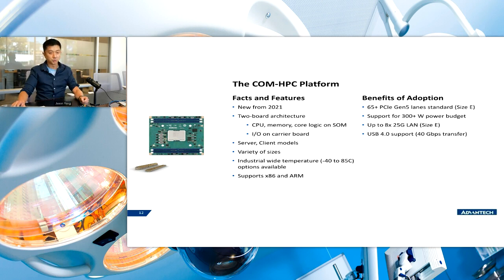We'll dive into the COM-HPC spec specifically. The flexibility of COM-HPC allows it to be integrated into many applications. The COM-HPC spec itself was ratified by the SGET committee in 2021, so it's still relatively new.